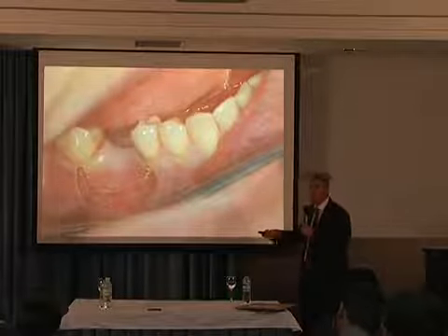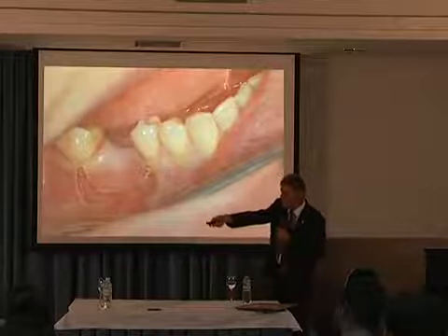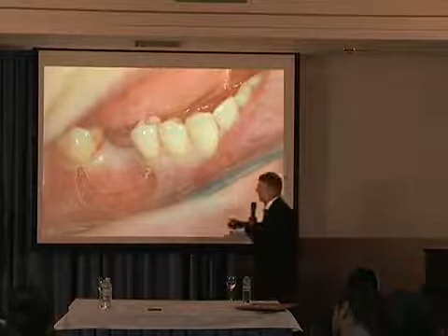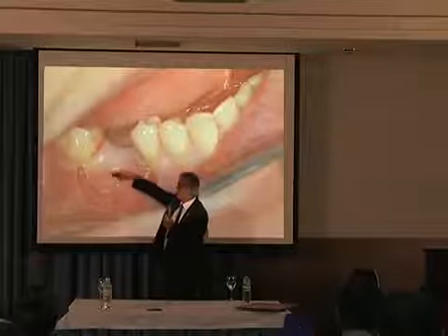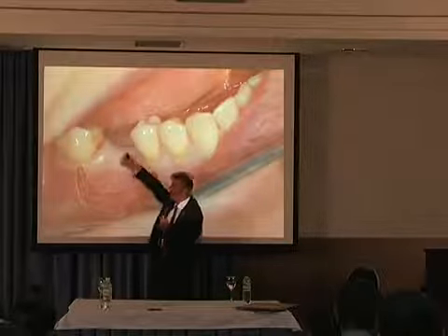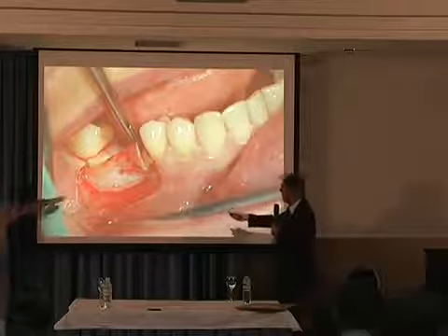Yeah? So we deliver a split flap, not with the scalpel. We use here the laser. Они поэтому делают разрез не с помощью скальпеля, они используют лазер. And just do in the first step a preparation of the mucosa, limited to the mucosa, only mucosa flap. Окей, и они вначале начинают подготавливать мягкие ткани только слизистой оболочки.